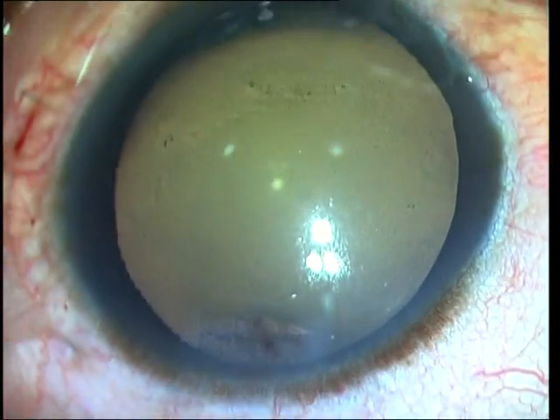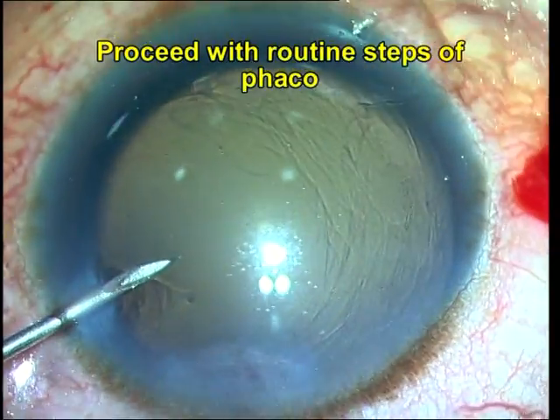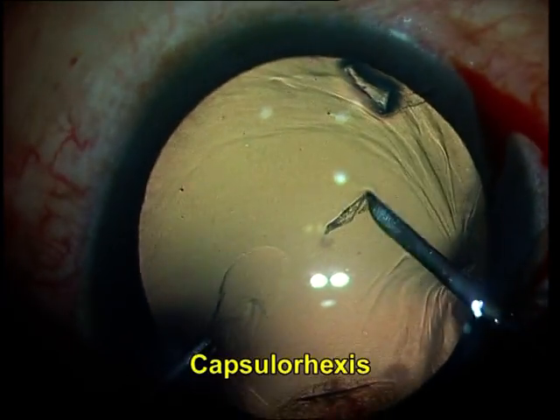Posterior to this is the scleral entry wound for the incision, and as the conjunctiva was slid forward before making your STAB entry, the conjunctival entry incision lies further posteriorly. FACO is now proceeded with.